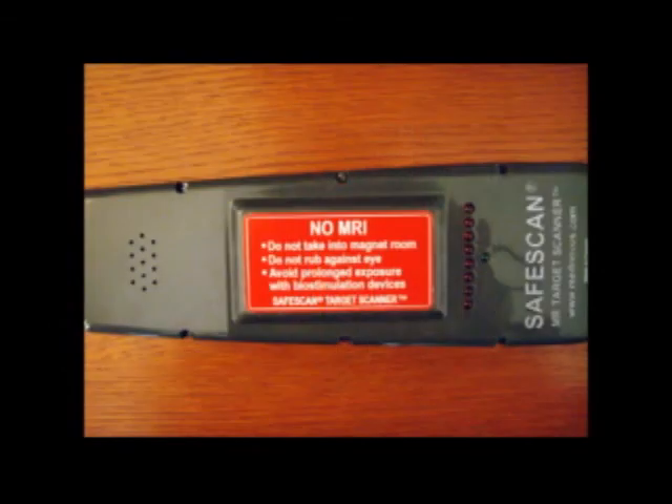The target scanner has three cautions. Number one: since it does have ferromagnetic components, it should not be taken into the magnet room. It is therefore tethered with an AC-DC step-down transformer. Caution number two: as the target scanner is not sensitive enough to find tiny intraocular foreign particles, it is best not to use it around the eye area.